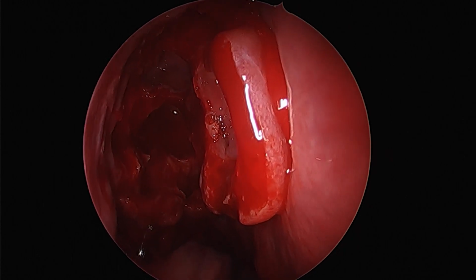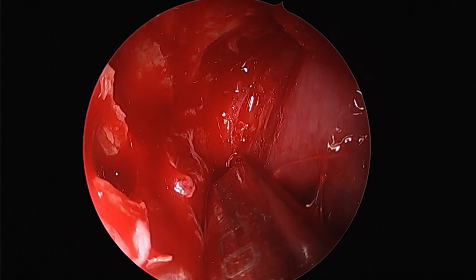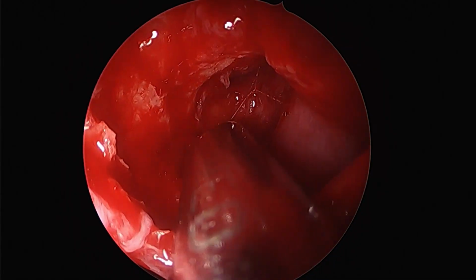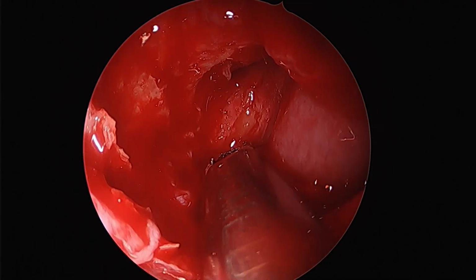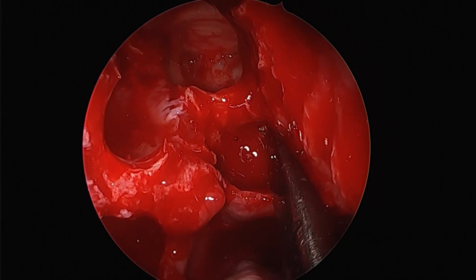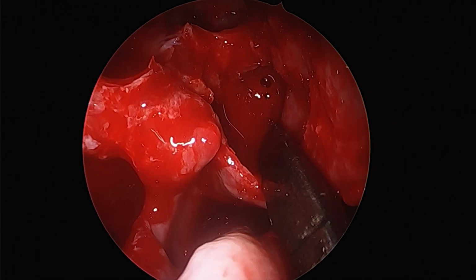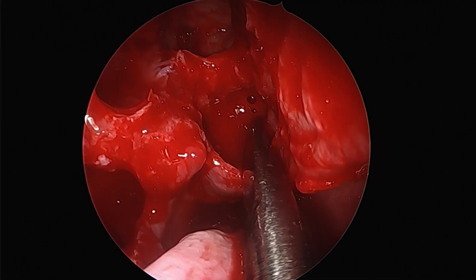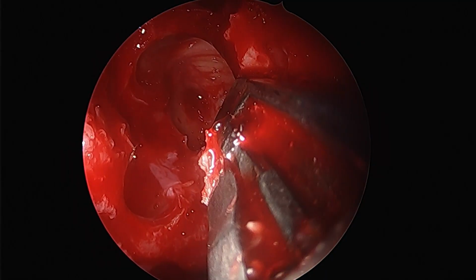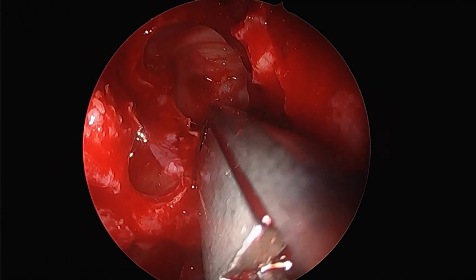Now, after some clearing of the remnants of the uncinate and the basal lamella, we go towards the face of sphenoid, which appears in this case as a very thick bone. Normally, we palpate this thick bone and we try to identify the ostium, or take a blunt elevator or an olive tip suction, or the face of a shaver blade, which does not point laterally, to create an enlargement of the natural ostium of the sphenoid sinus.